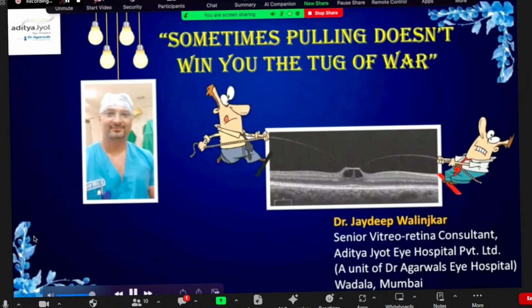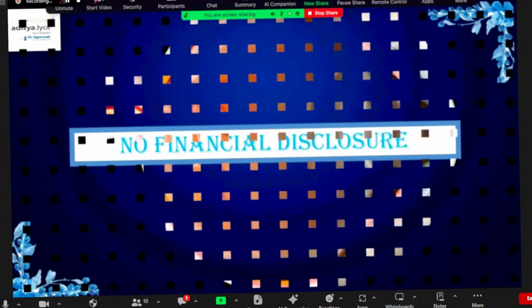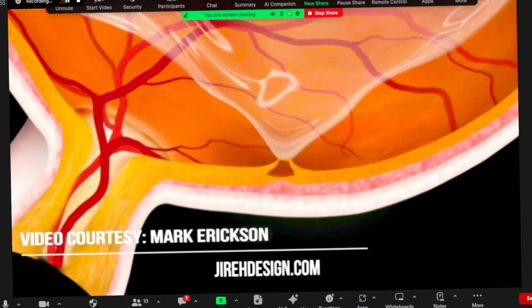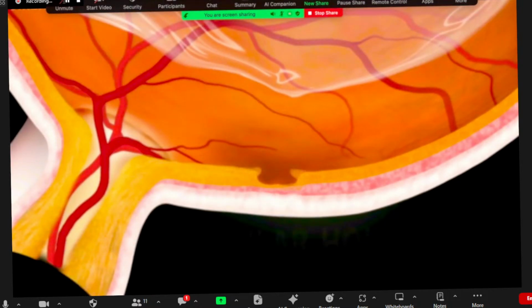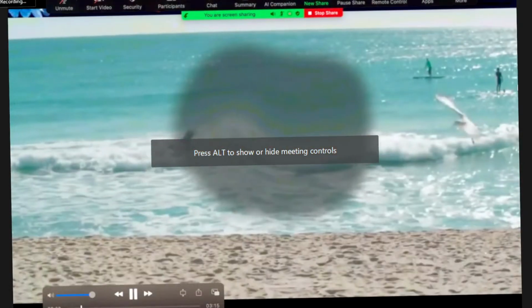Hello everyone, the title of my video is Sometimes Pulling Doesn't Win You the Tug of War. I have no financial disclosure. Many a times while operating a case of vitreomacular traction, by pulling at the vitreous, we end up developing a full thickness macular hole resulting in a central scotoma to the patient.